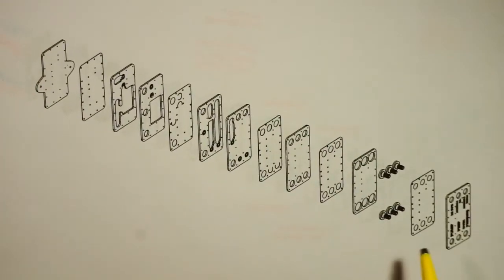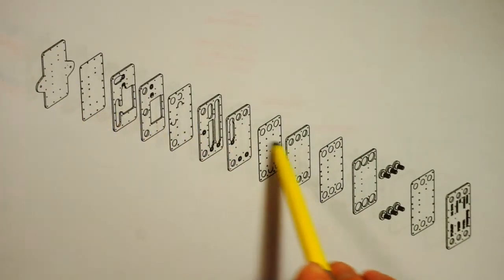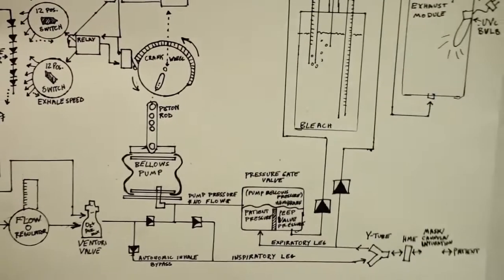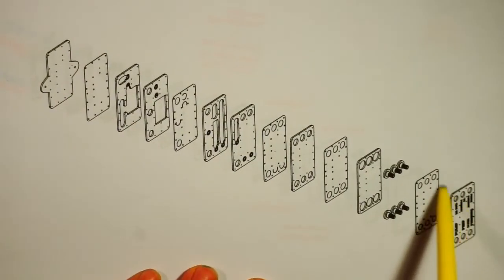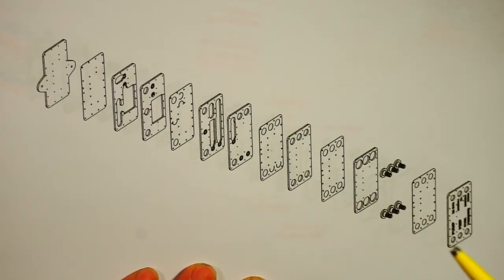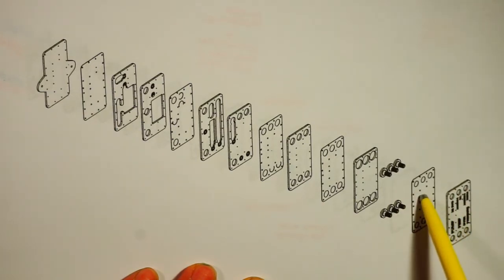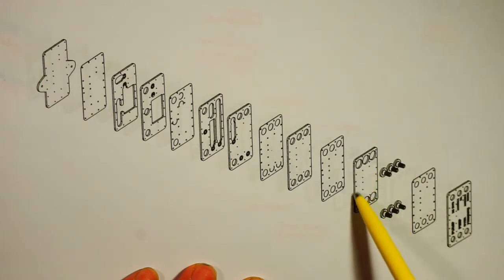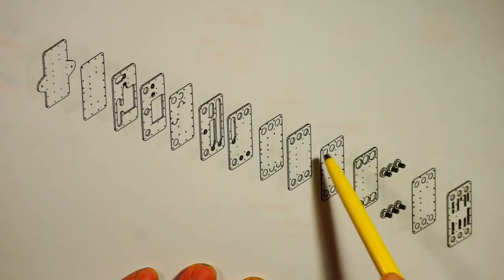Now I want to take a look at the physical structure of the valve block. This is a compound valve. It has all of the 6 valves shown in the system architecture picture here. But this is their actual physical layout in the CAD files. I've made an exploded semi-isometric view so that we can see each one of the layers. Before we get started with how it works, I just want to point out that this is a faceplate, this is a seal, these are the ports that go to tubing, this is a mounting plate, this is a seal, and this is a mounting plate.